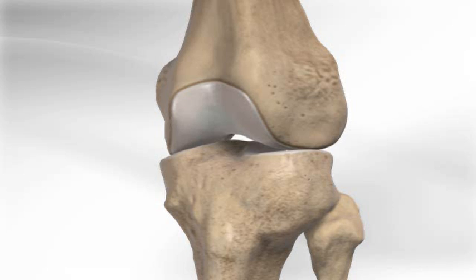All inside ACL reconstruction using GraftLink is a minimally invasive technique designed to reconstruct a torn anterior cruciate ligament of the knee. If the ACL is not reconstructed, meniscal tears and arthritis may occur in the knee.